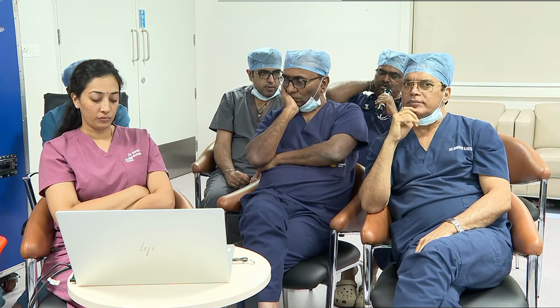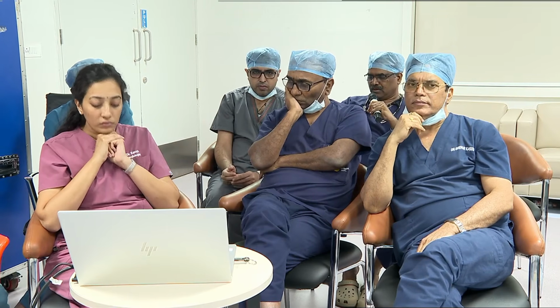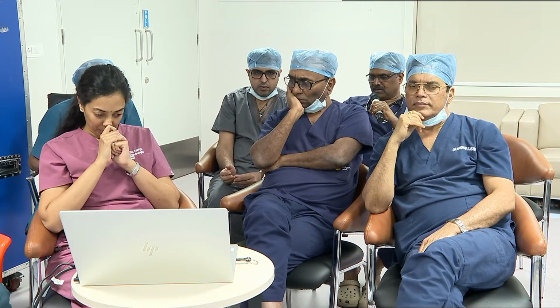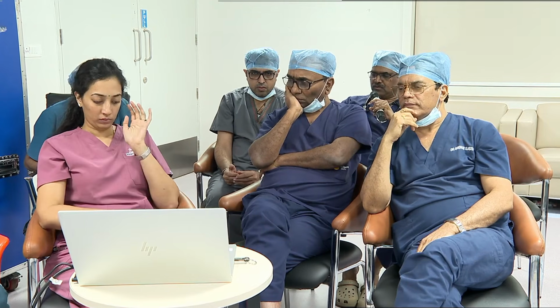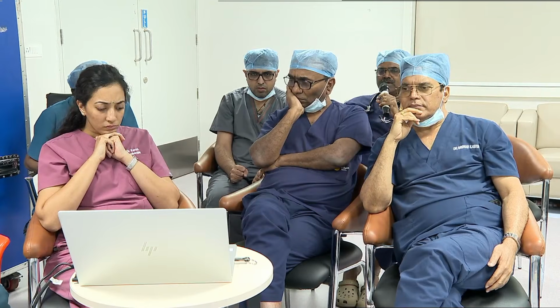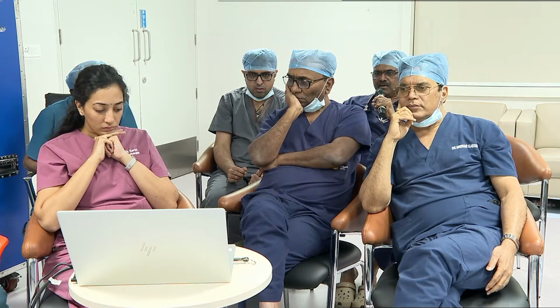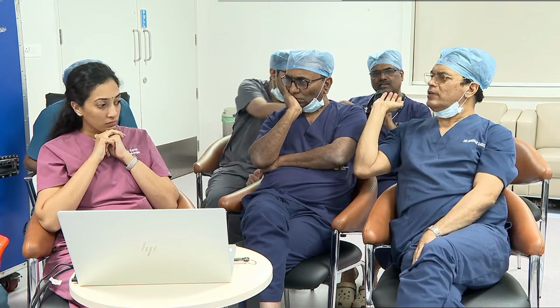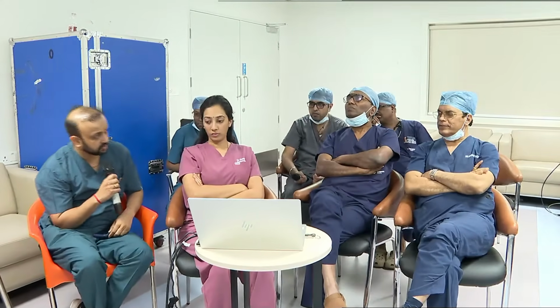The difference between coronary IVL and peripheral IVL is usually the aortic wall. The balloon should be less than 0.5 of the diameter, sir. Usually we should take the lesser size for the IVL in the aorta. So basically it is the size of the balloon and the pulses which are delivered.